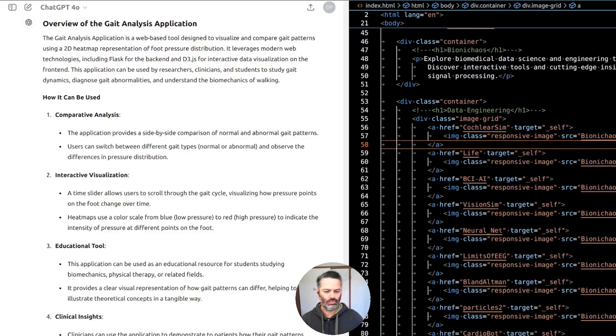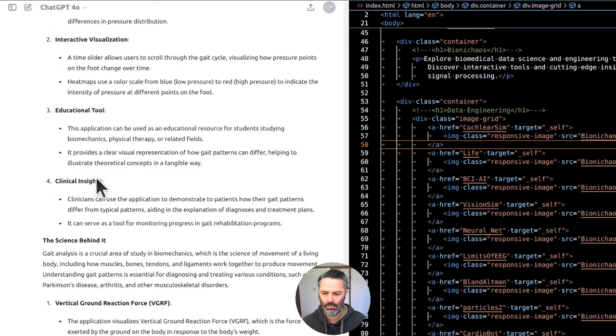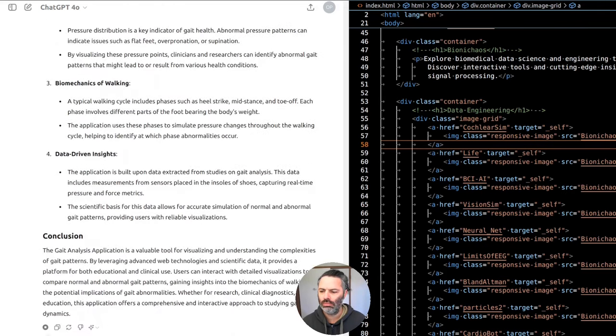The application provides a side-by-side comparison of normal and abnormal gait patterns. Users can switch between different gait types, normal or abnormal, and observe the differences in pressure distribution. A time slider allows users to scroll through the gait cycle, visualizing how pressure points on the foot change over time. Heat maps use a color scale from blue, low pressure, to red, high pressure, to indicate the intensity of pressure at different points on the foot.